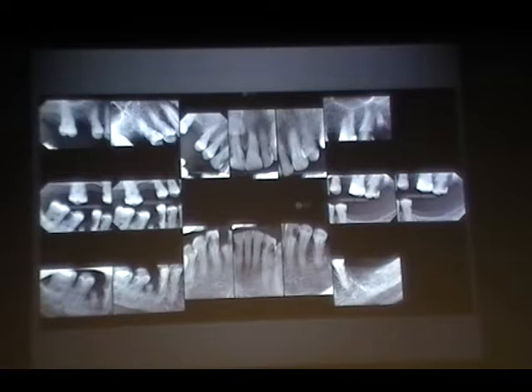Okay, moving on. And this one, it's great. Agreed. Looks like the contact between the molars is not all the way, or it might be not all the way. Are you on the third bitewing? Yeah, this one.